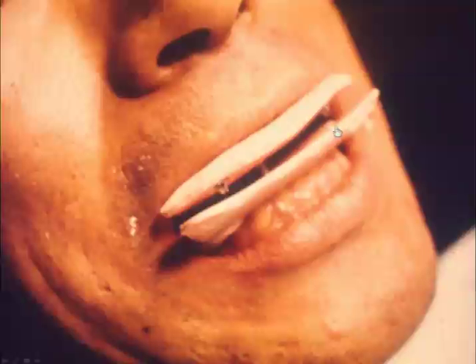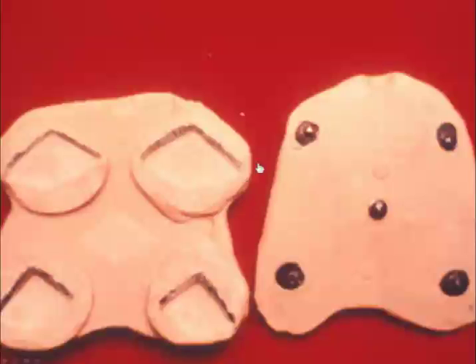The stereograph is actually two rigid bodies that move relative to each other, so it is a true pantograph. It had a central bearing screw in the center here, and it had these steel studs where they put soft material and had the patient move their jaws around in border movement and mold basically Posselt's envelope of motion. Again, you can see that we didn't see the so-called Gothic arch. It looks more like a Greek arch. Then they take these plates and mount them into the articulator and put some acrylic up in the guide system here, moving this around, molding a custom analog of motion specific for that patient.